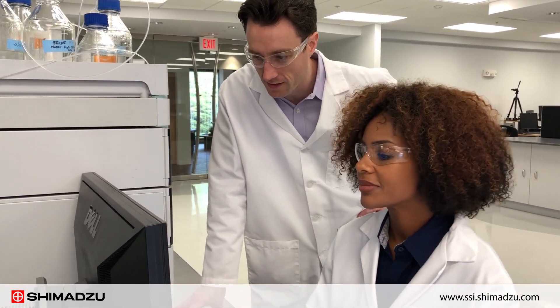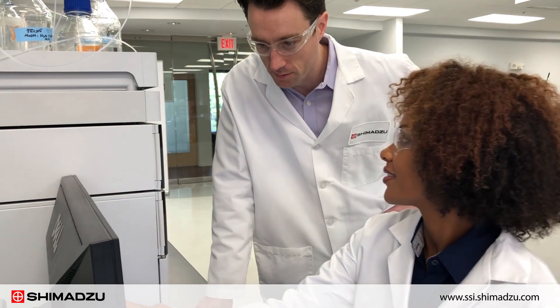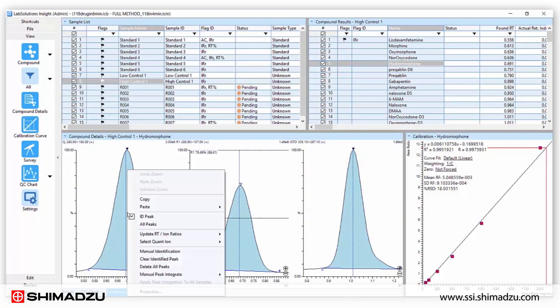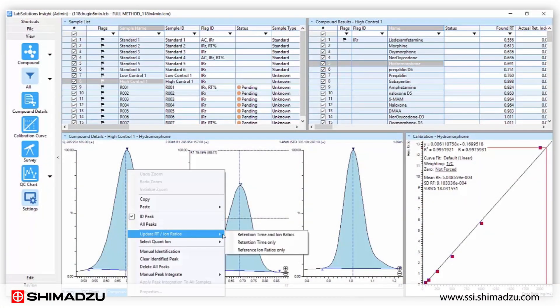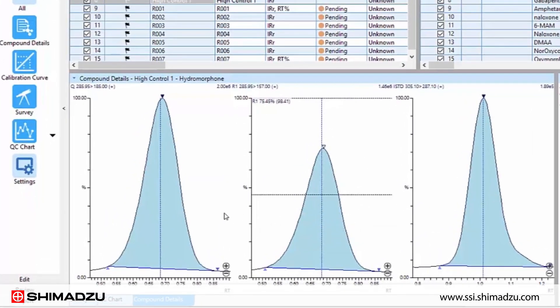Shimadzu's Lab Solutions Insight software offers easy viewing of the compounds of interest, including structural information, retention time, and library similarity score.